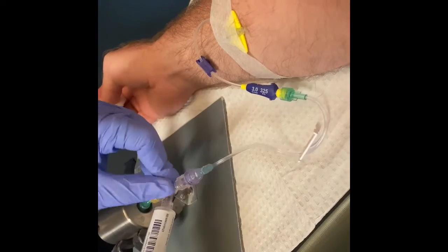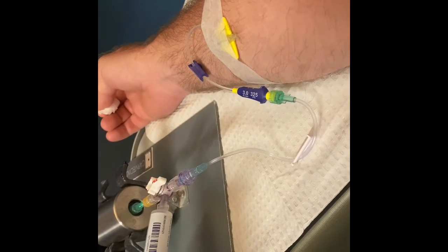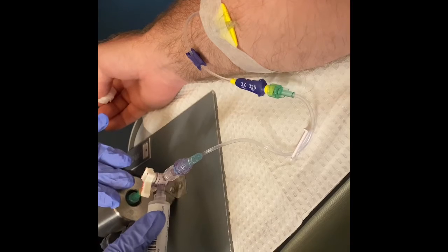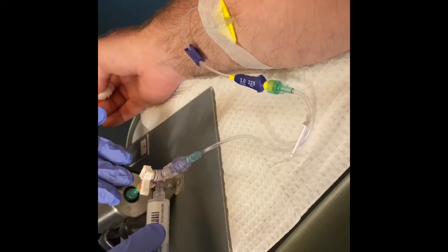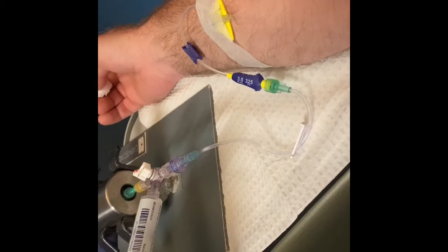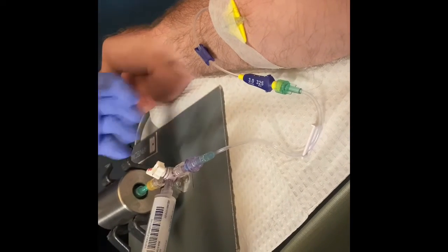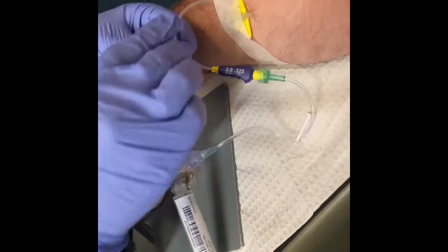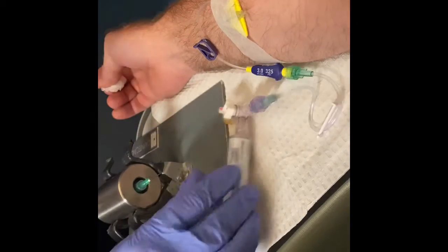And this is just like radioactive glucose. Pretty much. The radioactive part is just how our camera images what's coming off of you. And the glucose is there because anytime you have cancer, inflammation, or infection, you need energy for it to grow and survive. So we inject you with radioactive energy and see where it goes. It's amazing. That's pretty much the gist of PET. I don't feel anything, just a little coldness going in, feels good.